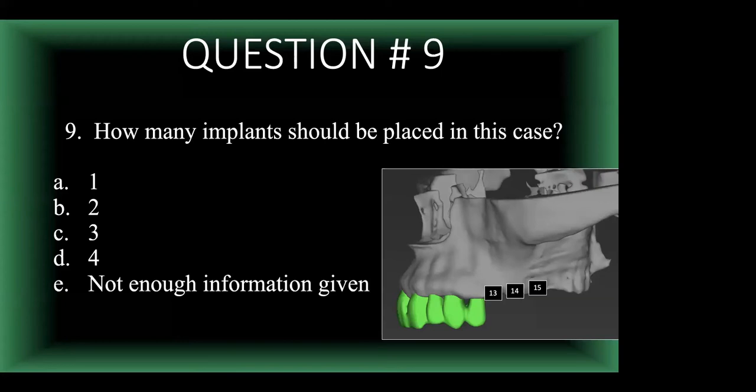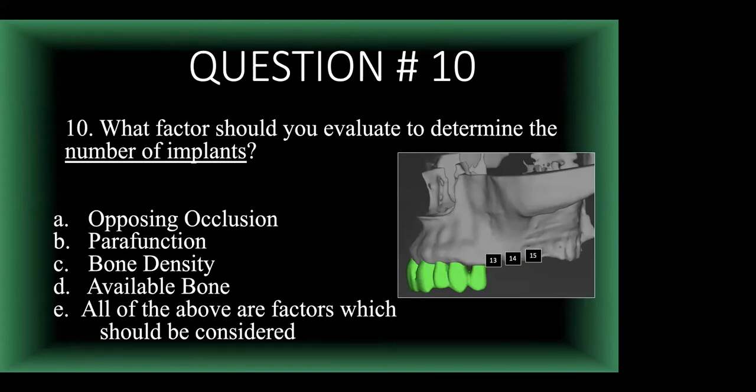And our polling answer is E. E is the correct answer, not enough information. So let me go over why that would be the correct answer. Actually, I'll do it with this question.